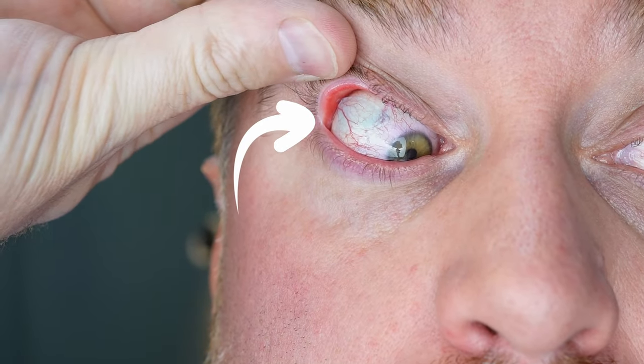I actually have a contact lens stuck underneath my eyelid right now, so I'm going to show you exactly how to get it out with some tips. There are actually a few ways you can get a contact lens stuck in your eye. The most common and most difficult to get out is where it's stuck underneath your top eyelid, like the one I have right now.